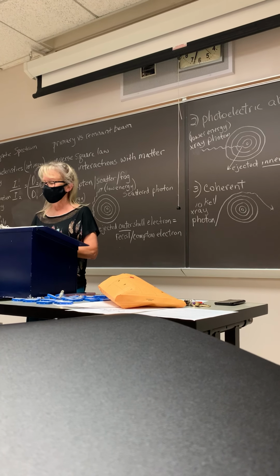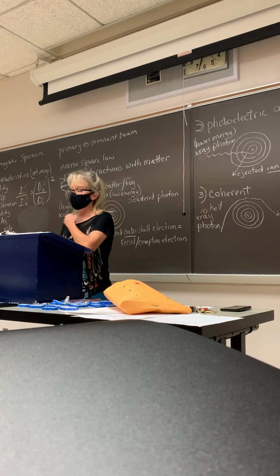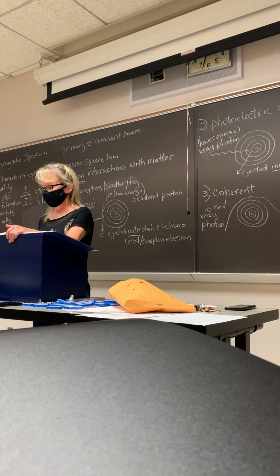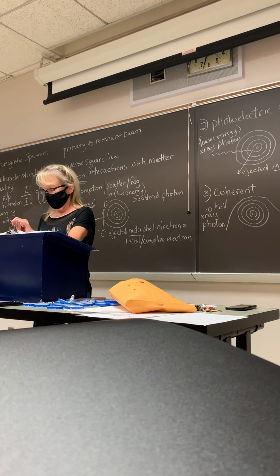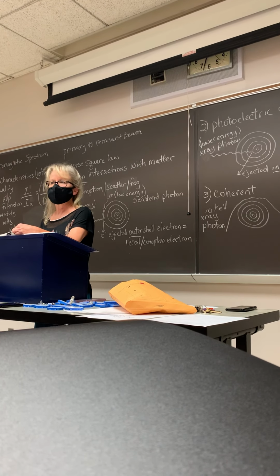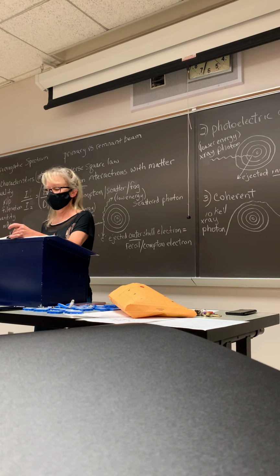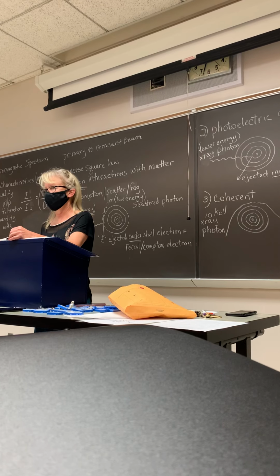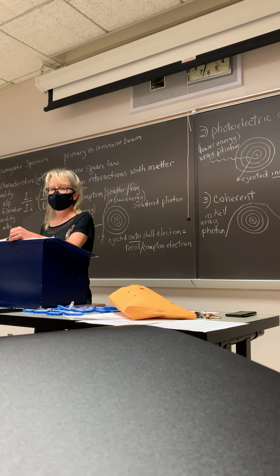Last thing. Okay, there's some more stuff on fluoro. It's just a repeat of what I just went over about exposure rates. The exposure cord on mobile units, what's the rule for the exposure cord? Good, it has to be at least 6 feet. So you can stand far, far away.